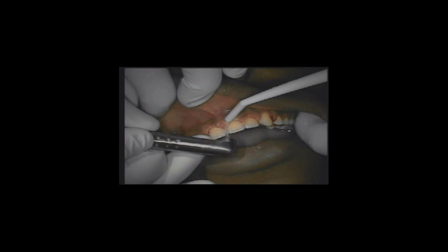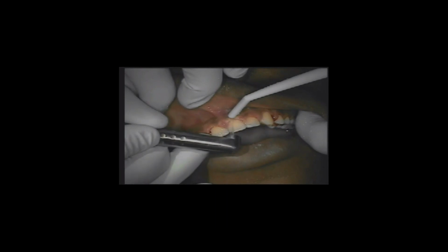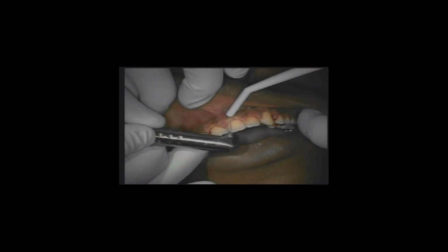So again, the first step is to just get our gingival shapes, get our zenith point, get our papilla shaped. And once we have things pretty much rough outlined, then we're going to go in and start fine-tuning and beveling, and then thinning those papilla, the bulkiness in the papilla as well.